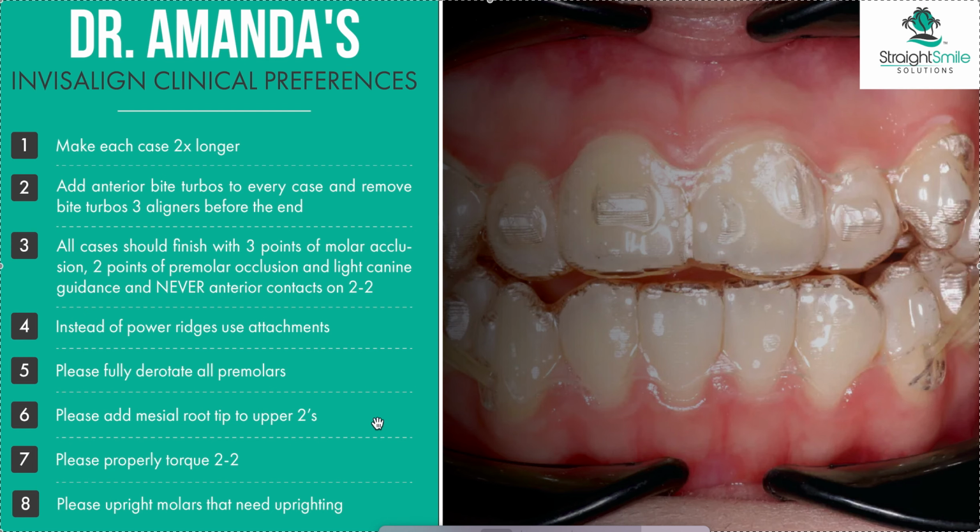So is that in my treatment plan? No, because not all cases need extra torque. But if I need it, I'm going to ask for it when it comes back.